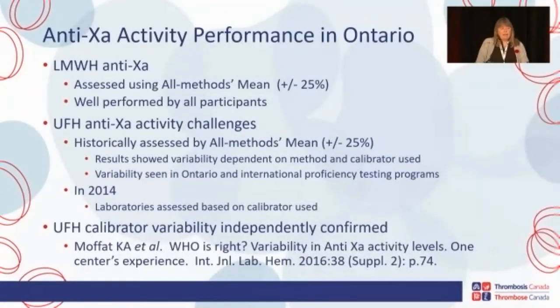So in anti-10A, the committee uses the all methods mean. Sorry, I'm not on the committee anymore. The committee assesses all data from all methods and all reagent combinations, and for low molecular weight heparin, anti-10A is very well performed across all laboratories. Again, it's a very small number of laboratories, but it's very well performed.